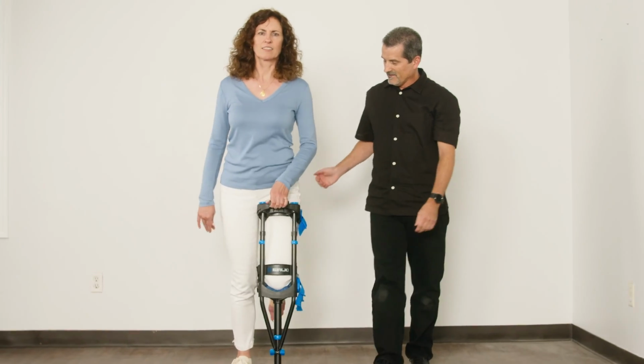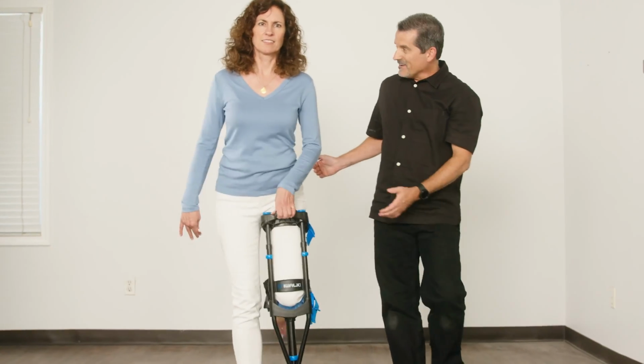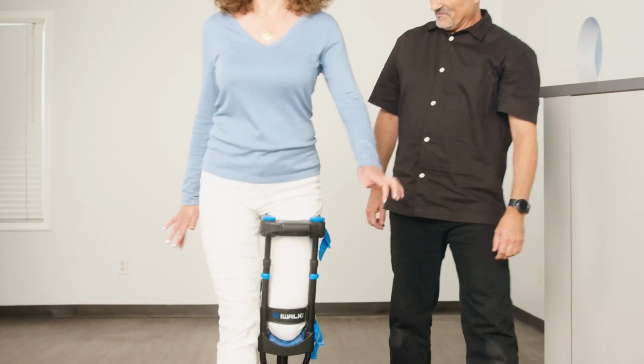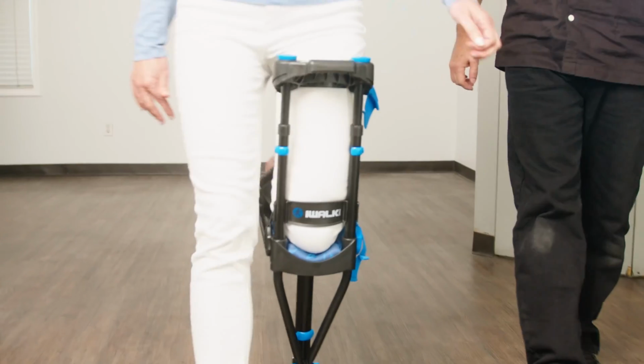Continue practicing for a couple of minutes. When the patient becomes proficient, it's time for them to go hands-free. Have them let go of the handle and continue walking. Their arms should be at their sides, swinging naturally.